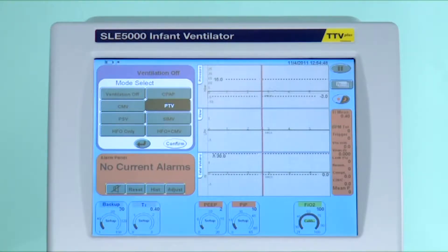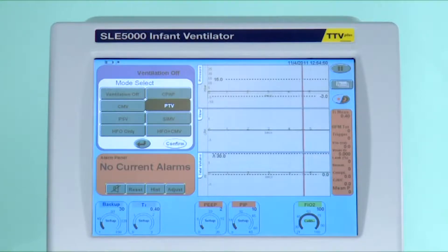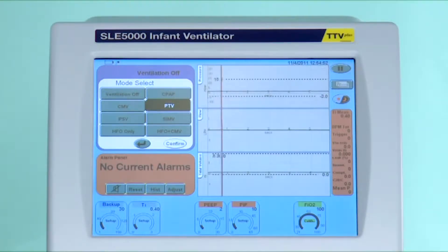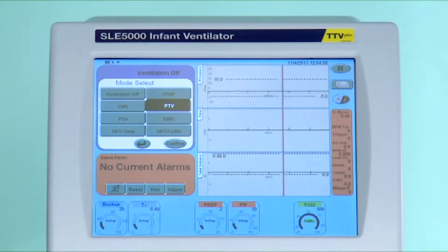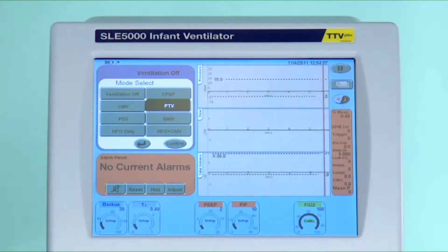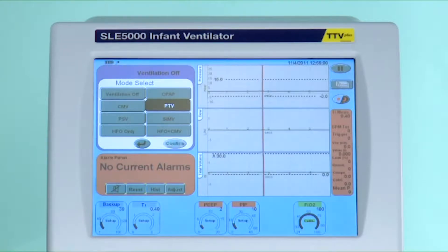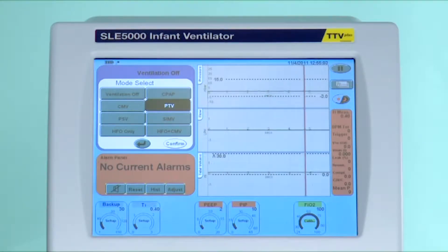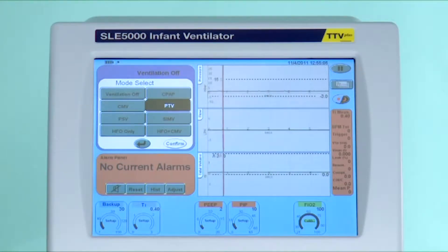PTV, or patient triggered ventilation, is the first triggered mode of ventilation, and the backup breath rate needs to be set at about 20 less than what the infant is doing. You will then set an inspired time, a PEEP, a PIP, O2, and a trigger sensitivity.